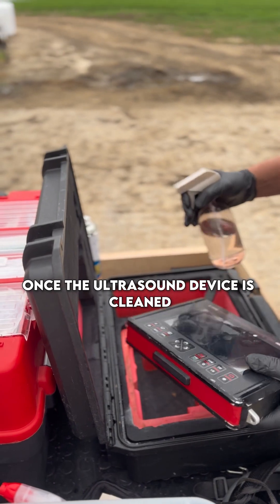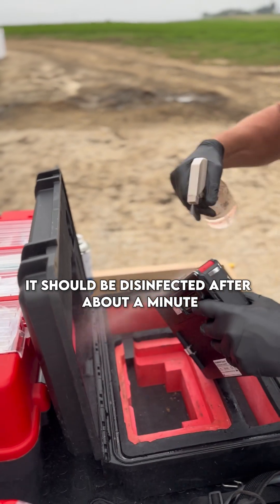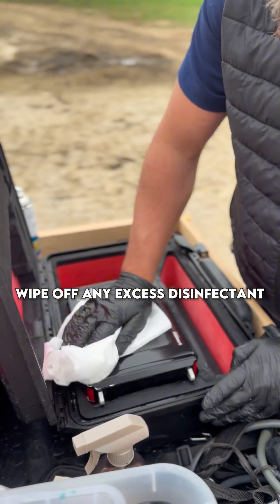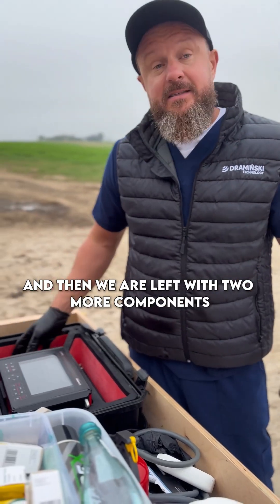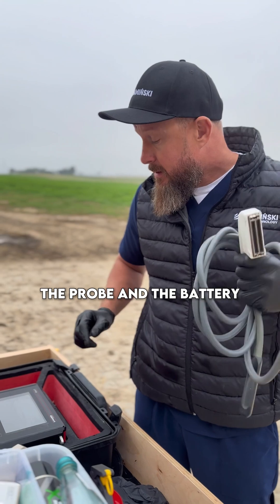Once the ultrasound device is cleaned, it should be disinfected. After about a minute, wipe off any excess disinfectant. The strap goes into the washing machine, and then we are left with two more components: the probe and the battery.